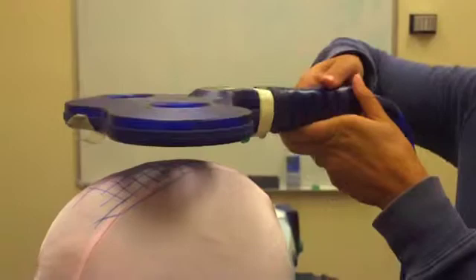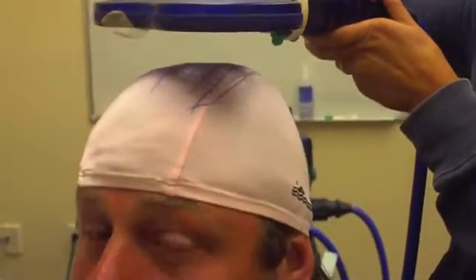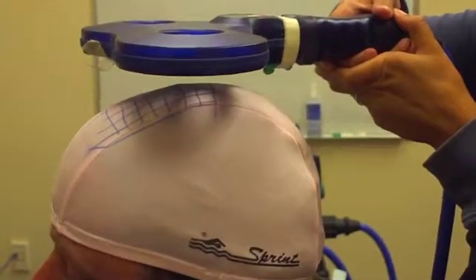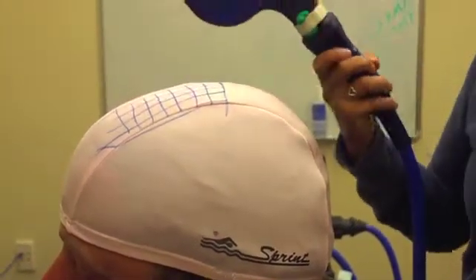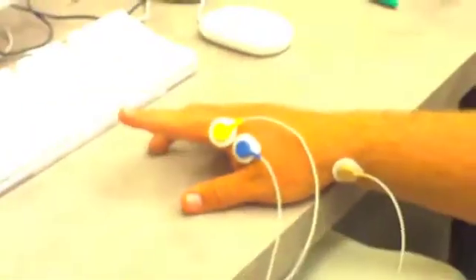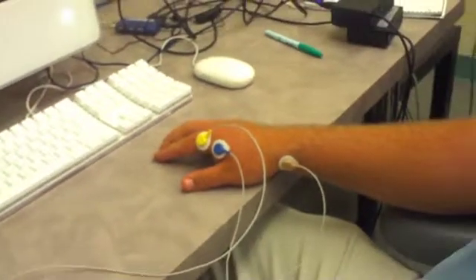So we'll hold the coil over the part of his brain that we're interested in stimulating or activating. And the magnetic field will generate an electric field, which will activate the neurons in his motor cortex. Then the signal will travel down his spinal cord through the motor neurons in his arm to activate the muscle in his right index finger. And then we'll record that muscle activity with these electrodes we placed, because muscle cells, like neurons, become more positive when they're activated.